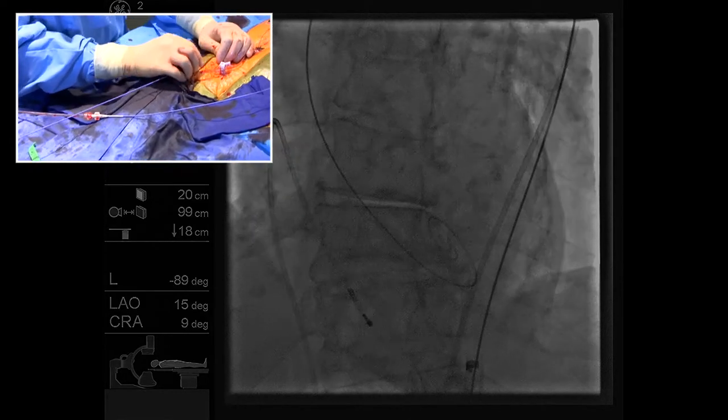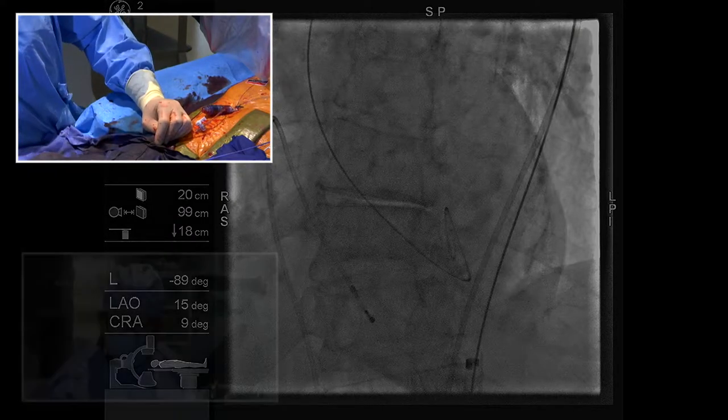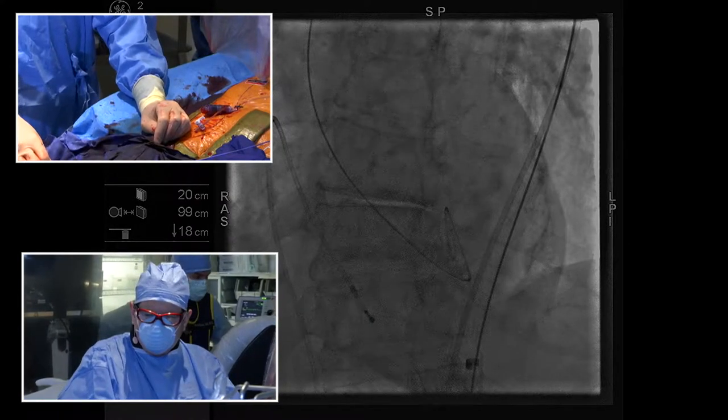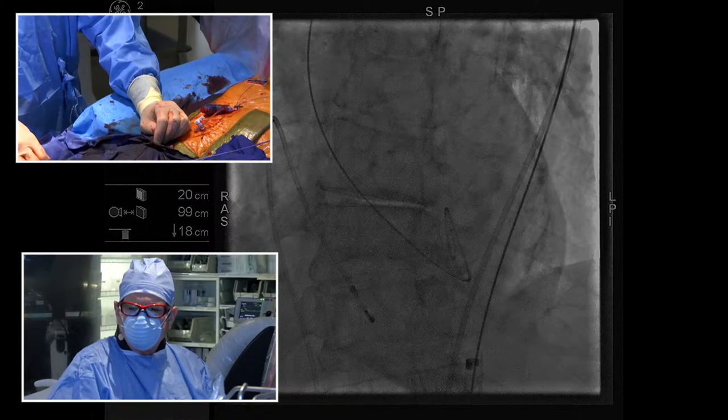Good. All right, we're ready now to do the balloon valvuloplasty, right? Yep. So we decided we're gonna do a balloon. We have a 20 balloon. So they're giving us the free balloon. The free balloon. It comes with the valve. It's not my favorite balloon.